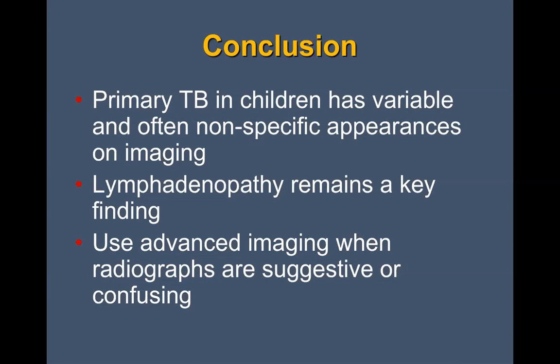Okay, and the second part is, would the recommendation vary depending on screening for school versus screening due to a known contact to TB? Well, yes, obviously you're going to have a higher degree of suspicion if you've got a known contact. If you're doing a large population screening process, then that's when 1-view chests are usually utilized, and that practice is probably not going to change, particularly in adults.